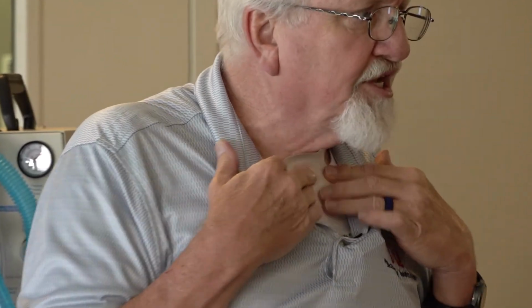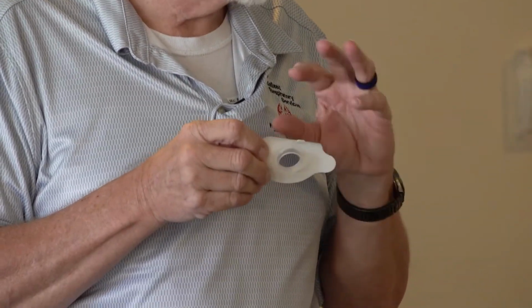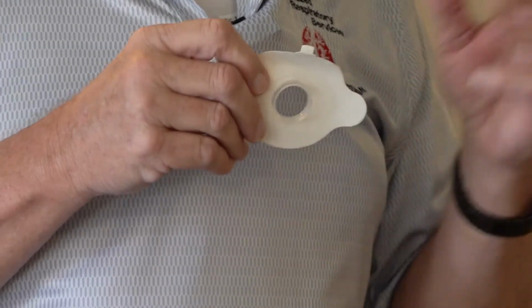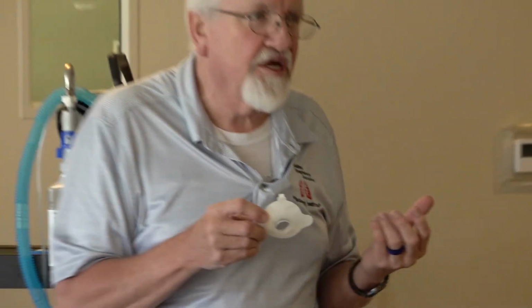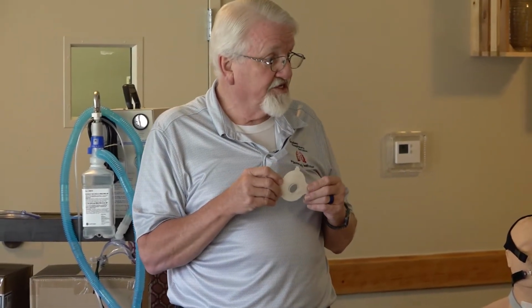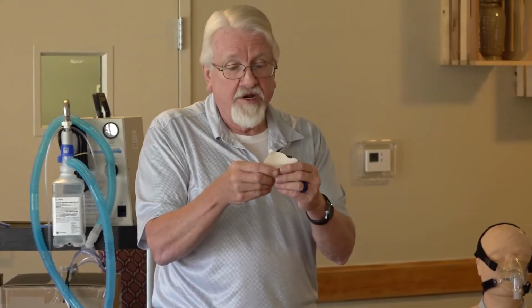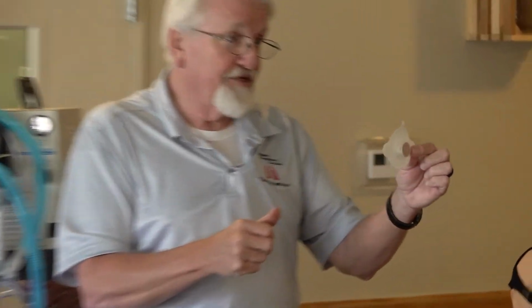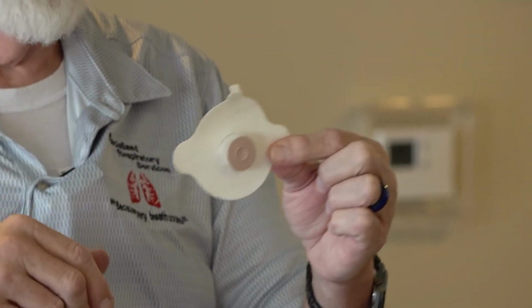So it's going to be just like that, and typically these are good for 24 to 36 hours, kind of depending on the patient. If they've got real oily skin or they sweat a lot, stuff like that, then it's not going to last near as long. But normally 24, 36 hours. And also, how convenient, the HME just pops into this too, so they still have some protection for the airway.